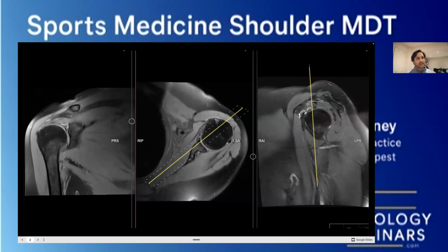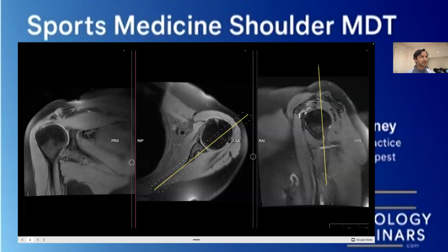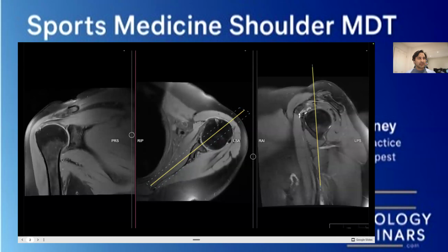Right. Is there any more on this scan? Has anyone noticed? No one said anything so far. So let's keep going. When you look at the axillary recess, this is the bit of your joint capsule that goes all the way around your glenohumeral joint. And sometimes that can look a little bit thicker and there can be a little bit of fluid. I think it's going to be difficult to really call. There could be a little bit of fluid around there, but it'd be a soft call. I wouldn't say 100% obvious, but there could be a little bit of fluid around that glenohumeral joint, which would therefore mean there's inflammation. And if there's inflammation, this must mean there's inflammation of the glenohumeral joint, which is otherwise known as adhesive capsulitis. But there was one big thing on here, right?